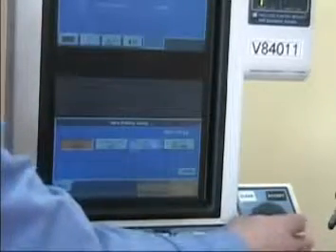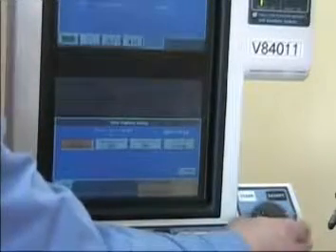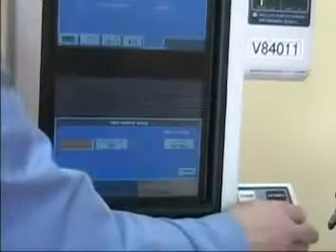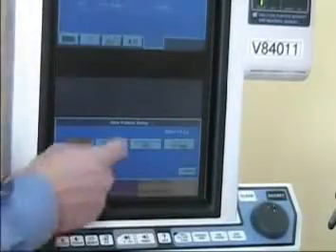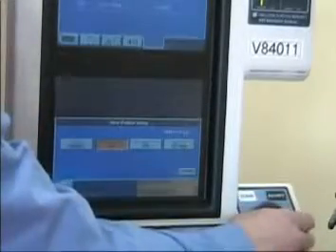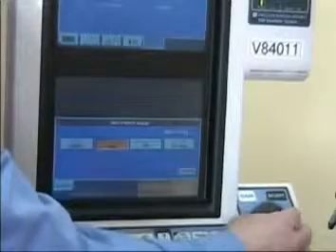Now we can select the type of mode that we want. We have assist control, SIMV, spontaneous, or bi-level. Let's set this in SIMV. Next we can have volume control SIMV or pressure control SIMV. We'll use volume control SIMV because that's most typical.